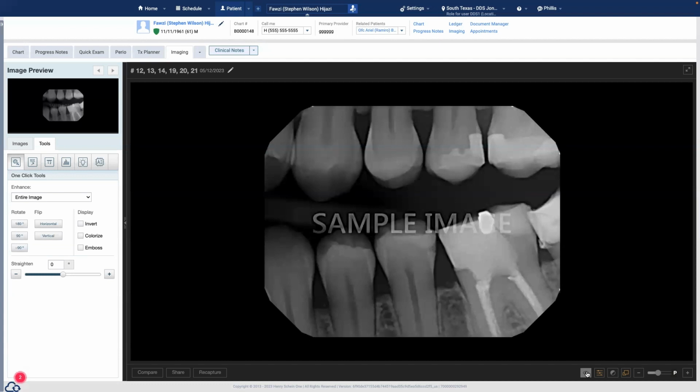I had a doctor that told me once that she had a conversation with her patients after setting this up, and she said, I just tell my patients I've invested in an AI system that helps review those x-rays and provides me an extra set of eyes.